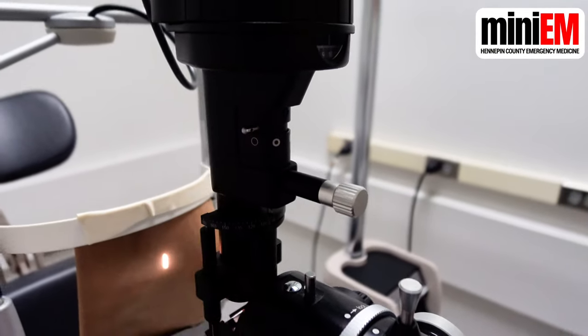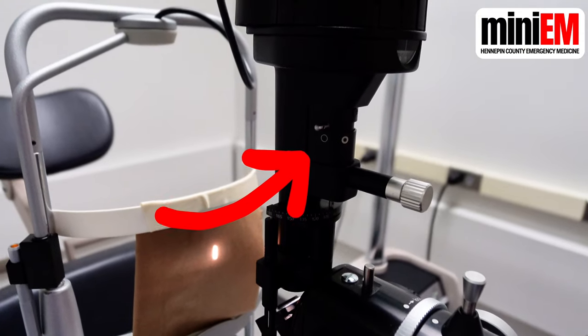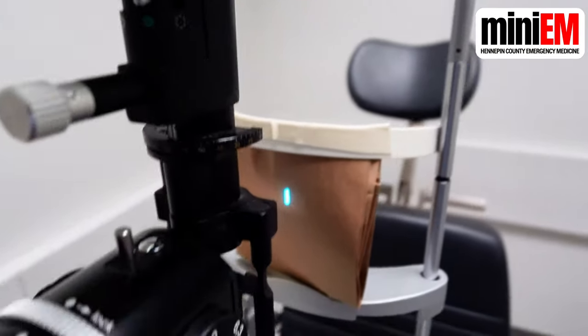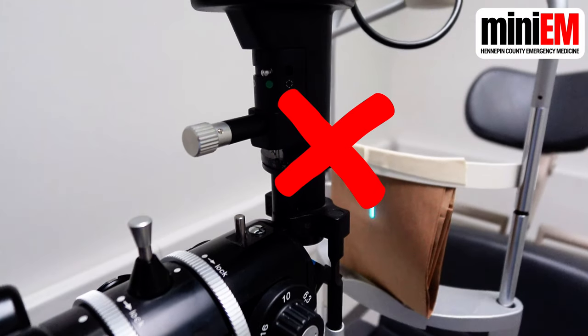Find the light filter and flip it to the open circle, which is a bright yellow light. If you flip this all the way to the right, you'll get a green light, which you should never use. One common mistake is thinking that this is the thing you use for the fluorescein exam — we'll show you that later.